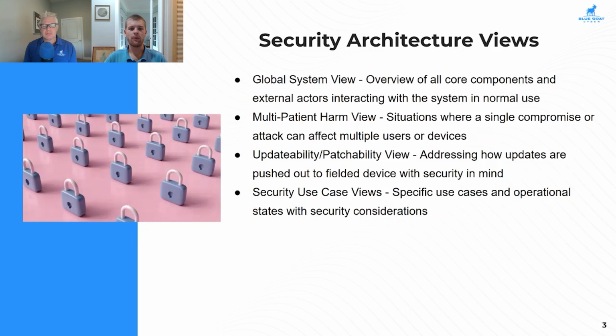Updatability and patchability view is how we talk about where security is built into the update process and how these are pushed out to fielded devices. Security is extremely important when we're addressing updates. Now, updates can often be a little bit of a security sensitive topic due to the fact that the process can be so easily compromised. Update infrastructure can often be vulnerable to cybersecurity vulnerabilities, even more so than the device itself. So we want to make sure that security is addressed throughout the entire update process, through the users interacting with the update process, through the developers on the internal side of things. It needs to be an end-to-end view.